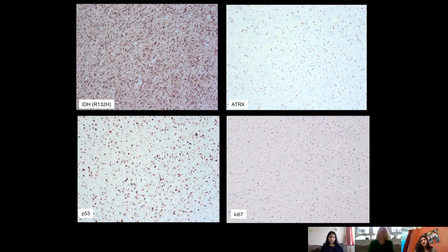So here the immunohistochemistry shows again positive immunoreactivity for IDH1, indicating mutation. It also shows loss of ATRX. If we look here on the right side, we see that reactive cells of normal CNS parenchyma, endothelial cells, inflammatory cells are positive, but the neoplastic cells in between are negative, indicating mutation.